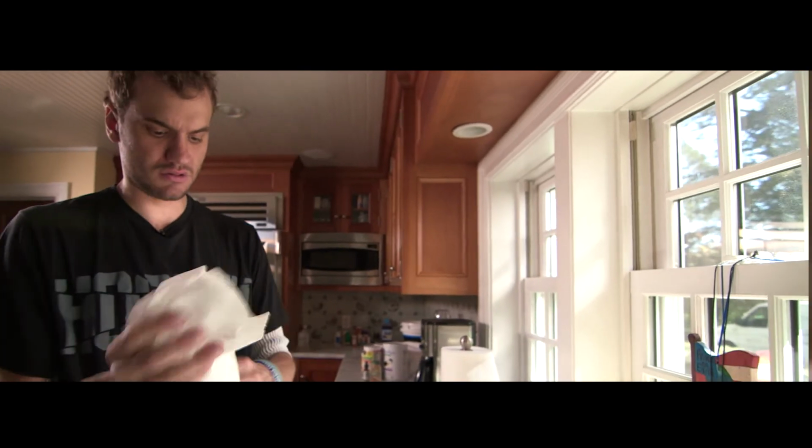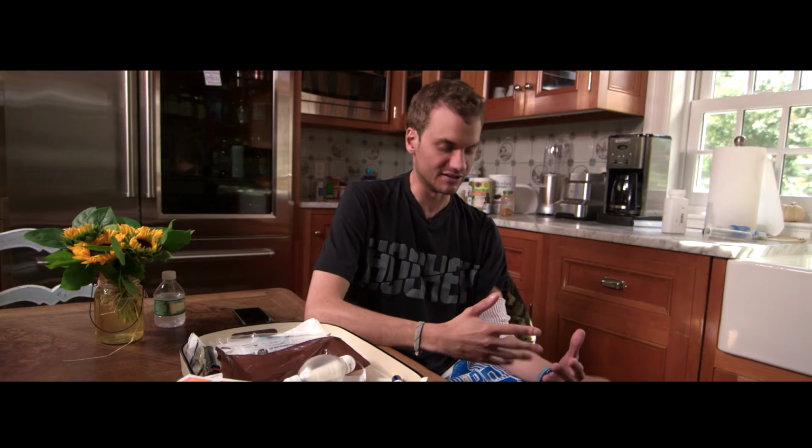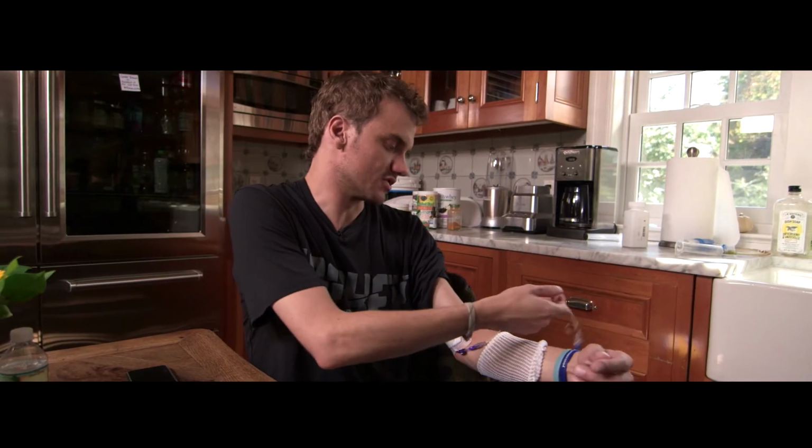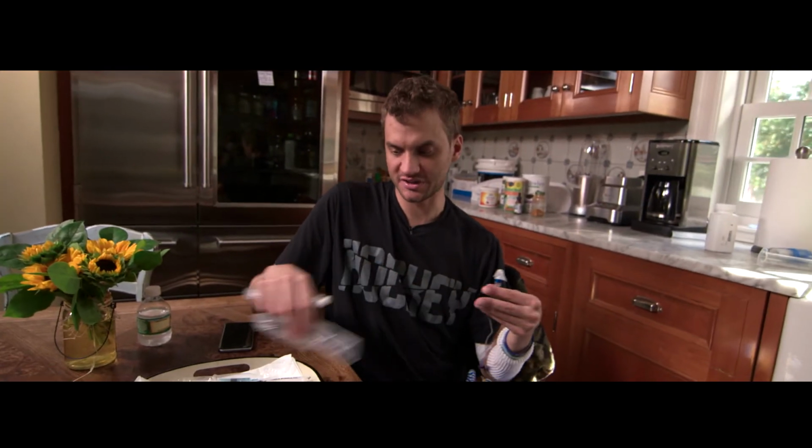My parents are trained, I'm trained to work with my IV, with a home care nurse and a home care team. When you're working with an IV and something that's intravenous, everything has to be very clean, so we just clean my hands. First step here is we're gonna make sure we use our alcohol swabs. From there, we'll flush it with saline.